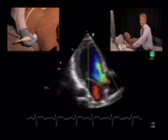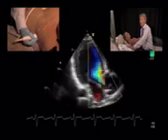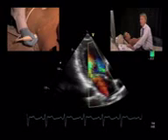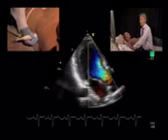Okay, now let's also take a look at the regurgitation here in the apical long axis view. And we see that it's quite wide at the origin. So this again speaks in favor of an at least moderate to severe, probably even more than moderate regurgitation, probably somewhere towards severe. So even though it's not easy to assess the severity, especially in this form of jet, together with the other findings of regurgitation, we can come to a diagnosis with respect to the severity.